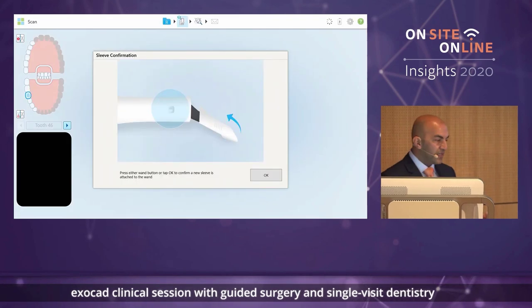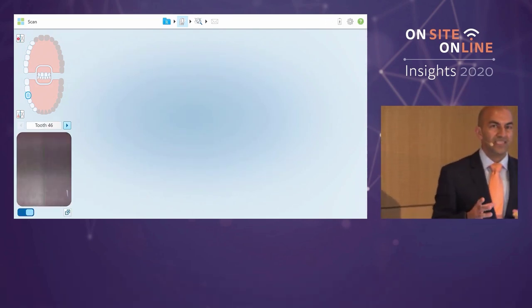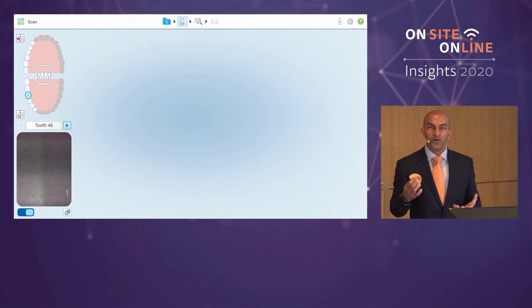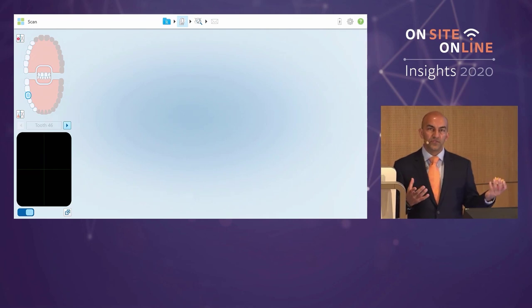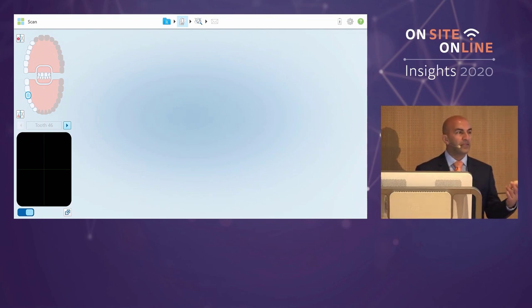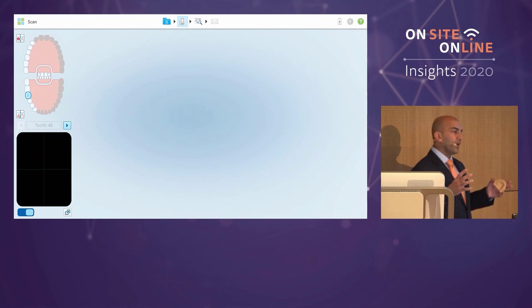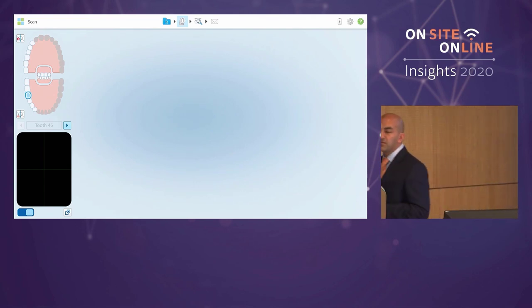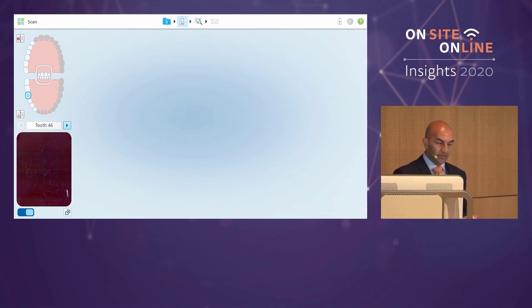While the scanner is activating, it's important for you to know that when doing chairside dentistry, all of it is full ceramics. It's vitally important that practitioners apply the right margins — shoulder margins for strength of full ceramic restorations. I recommend that people new to scanning use good magnification and really good lighting to make life easier, because this is a realm where practitioners are taking on the role of a technician.